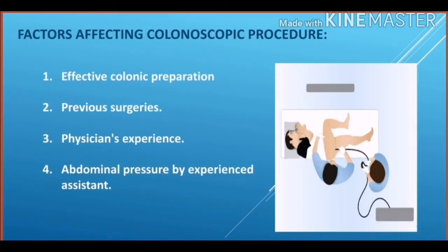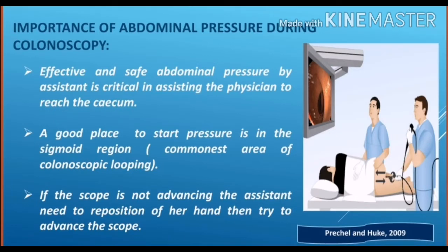Factors affecting colonoscopic procedures: effective colonic preparation, previous surgeries, physician experience, and abdominal pressure by an experienced assistant. Effective and safe abdominal pressure by the assistant during colonoscopy is critical in assisting the physician to reach the cecum.